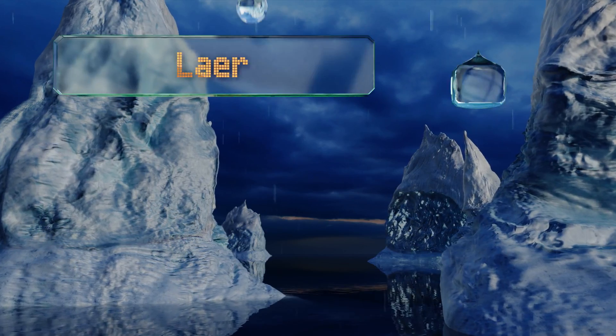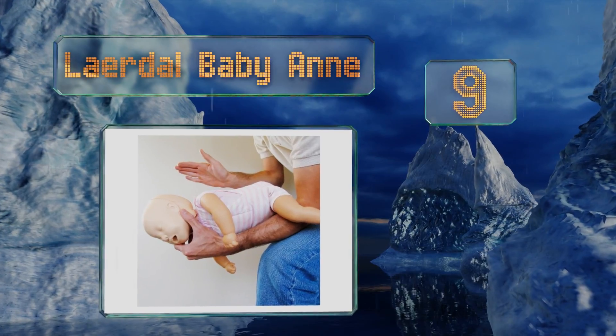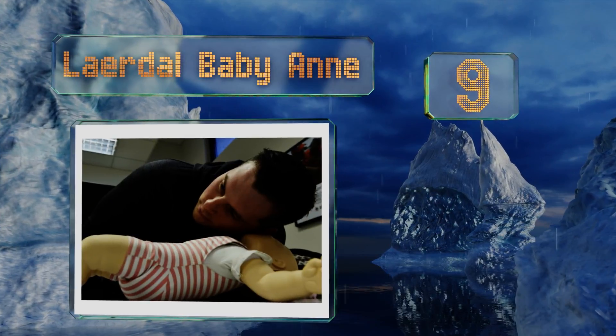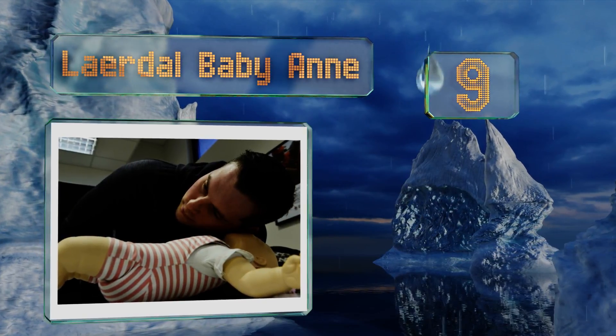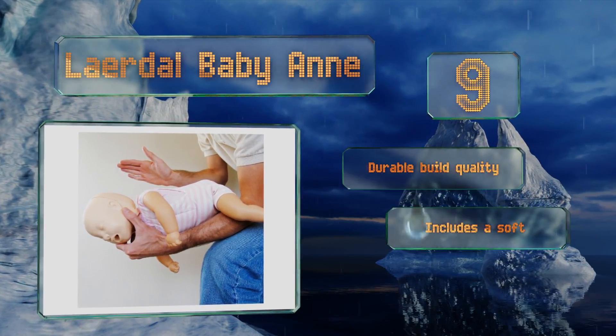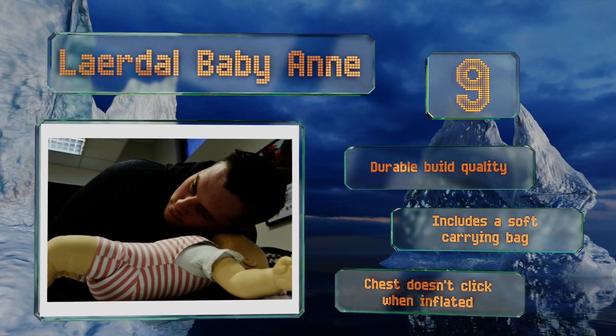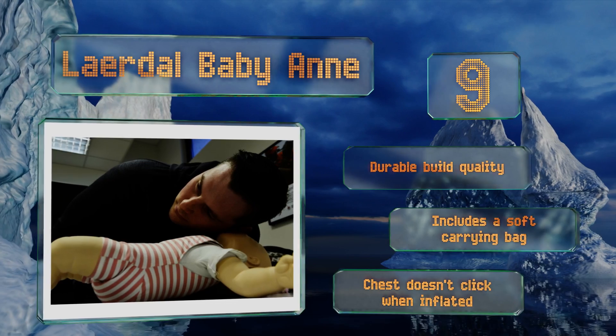At number nine, the Laerdal Baby Anne not only allows students to practice cardiopulmonary resuscitation but also comes with 10 foreign body objects that can be placed within the airway to work on back blows and chest thrust obstruction release techniques. It offers a durable build quality and comes with a soft carrying bag, but the chest doesn't click when inflated.